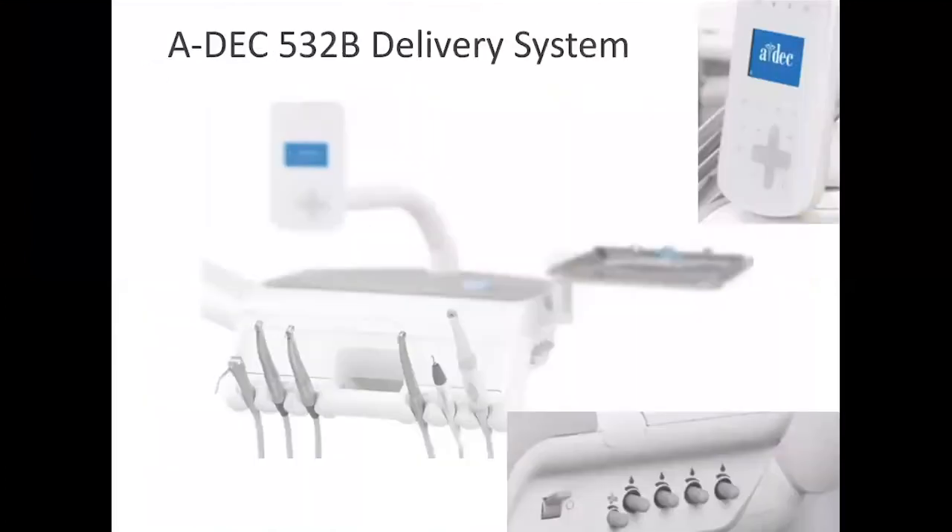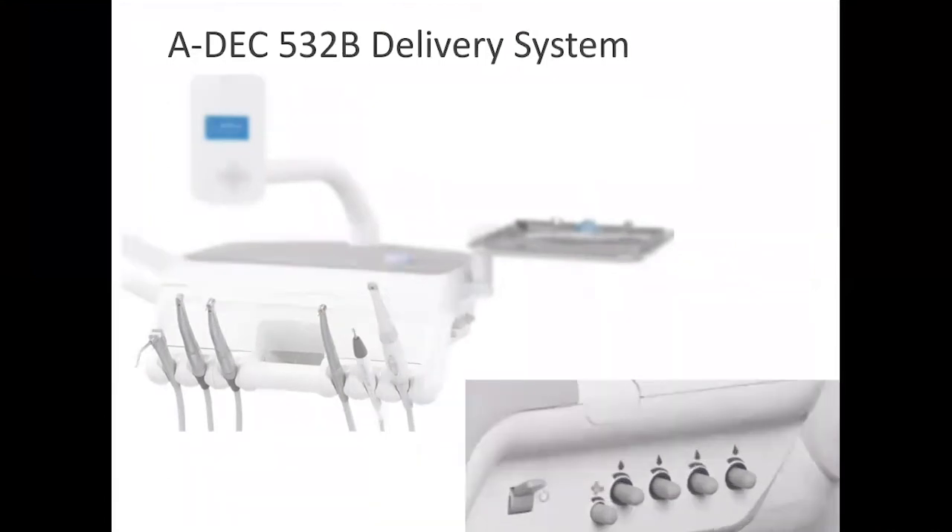The system you're using is the ADAC 532B delivery system. The water adjustment is on the side of the delivery unit, and each of the knobs corresponds to a position on the tray. When you lift the handpiece of the piezo scaler out of the tray holder, the knobs on the side will be illuminated by a blue LED light so you'll know exactly which knob to adjust.